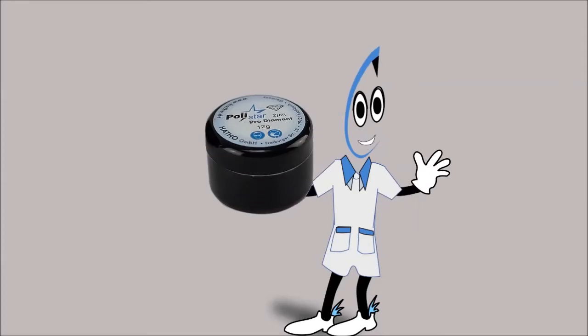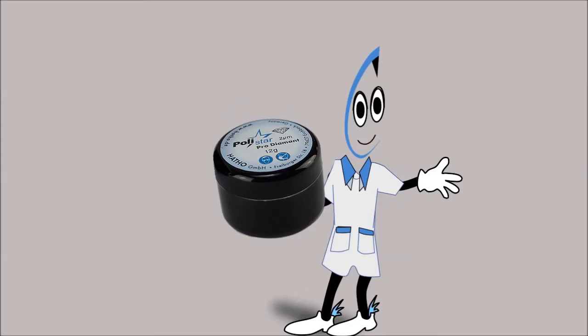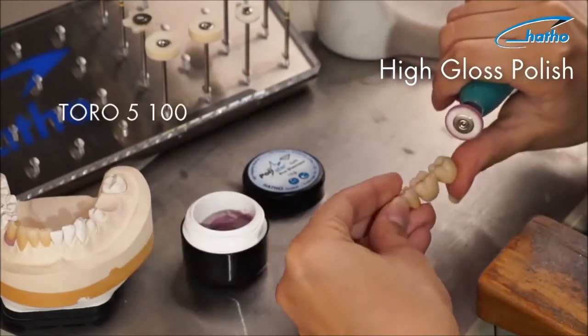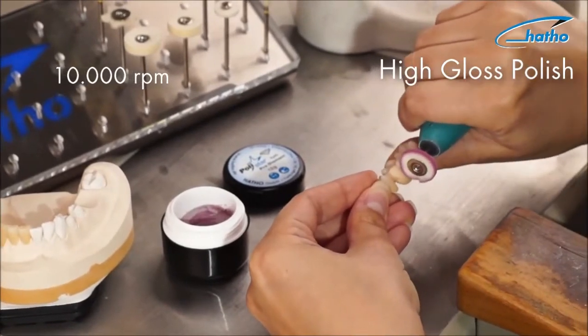Now we will demonstrate the high shine polishing technique using goat hair brushes and a felt polisher. In order to polish ceramic buccal surfaces we suggest the toro polishing brush made from goat hair, applied at a speed of 10,000 rpm.